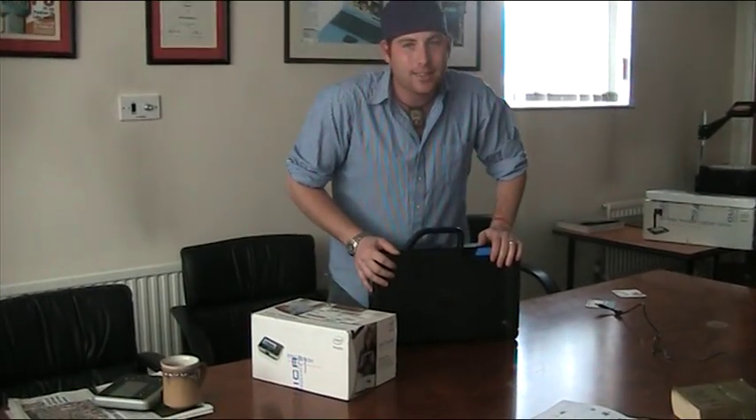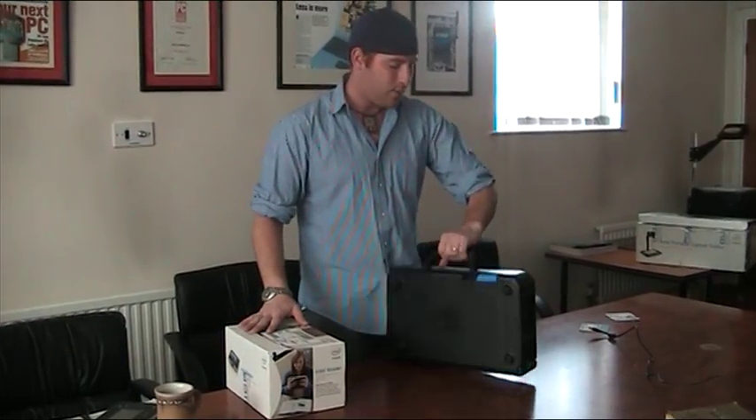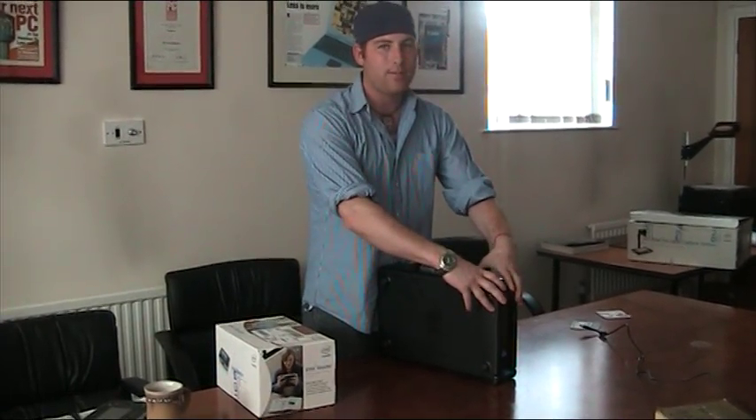I was lucky enough to get my hands on one of these bad boys. Basically what we're going to do is see how fast we can put it together and how it actually stands up to all the hype. First things first, we have the Intel stand, which comes in kind of a suitcase-like contraption. It weighs probably around 4 or 5 pounds.